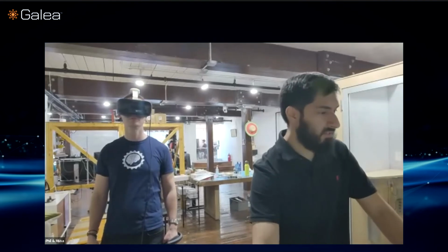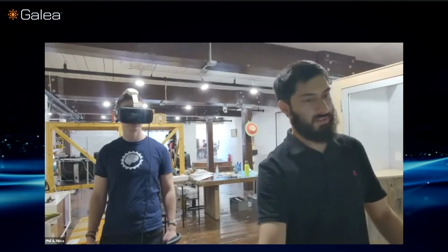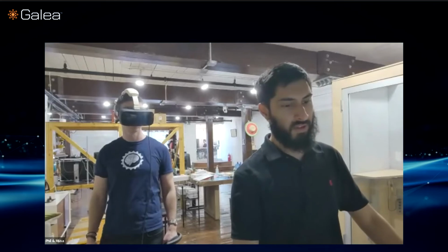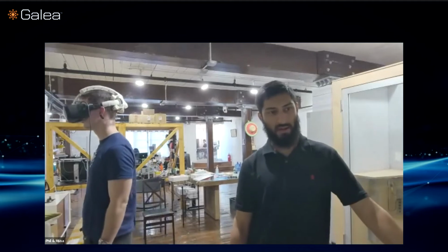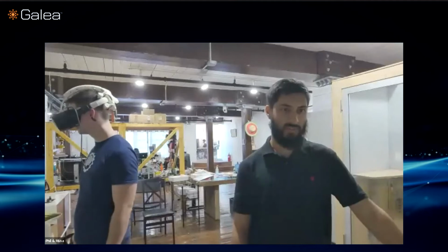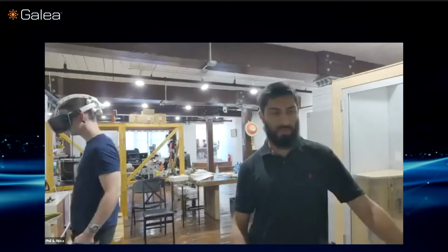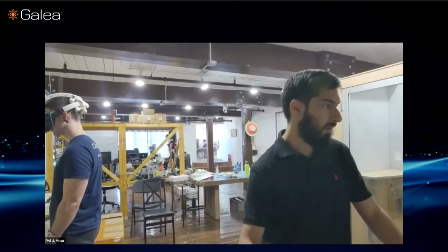Yeah, so we're using this EMG. I need to pull up the game one more time. One second. But the EMG is basically giving you additional functionality. So in this example, we show that he has his hands full trying to control this pipe game. So we are using this biometric data, which tracks the EMG facial muscles in order to control this interface. So he can perform different face gestures, and you can accurately control the interface while his hands are busy.